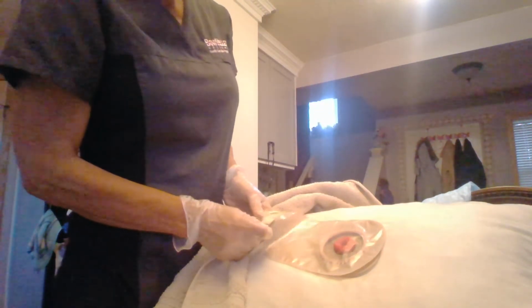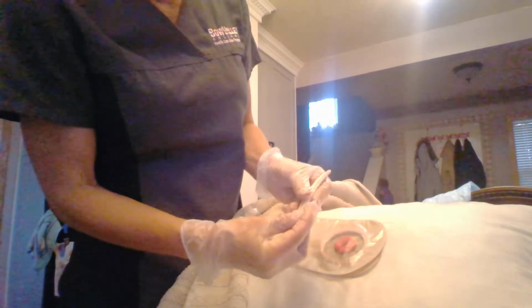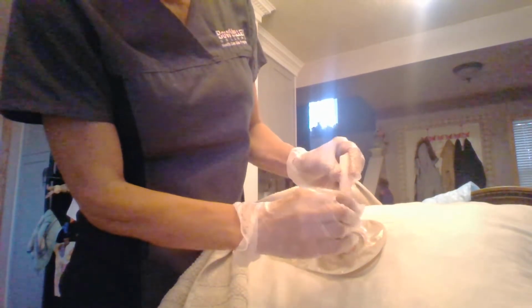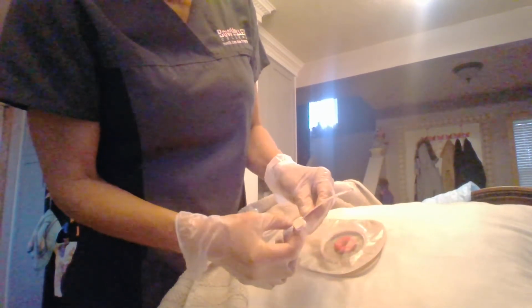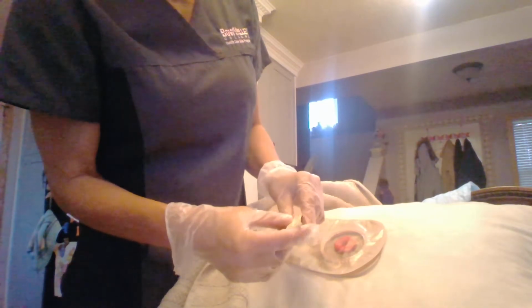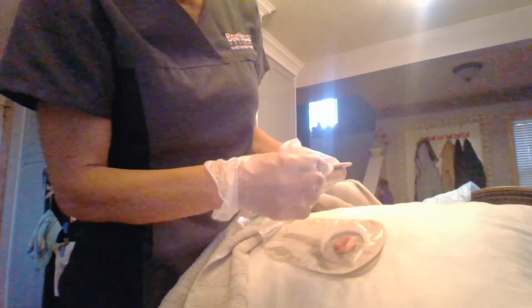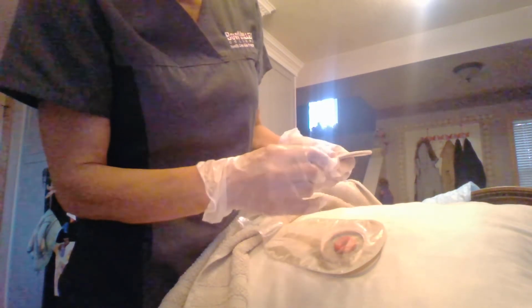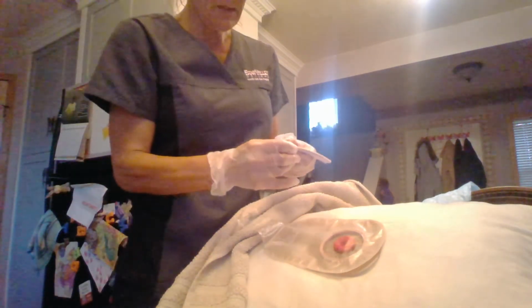Now, this system comes with a clip. My clip does not work anymore. It doesn't even snap, but it snaps into place. The curvature of the clip is to the client's leg, or the comfort of the client's leg, so you can't see it. So you actually have to hear this clip, or hear this snap. This one doesn't snap anymore because I've been using it and stuff.